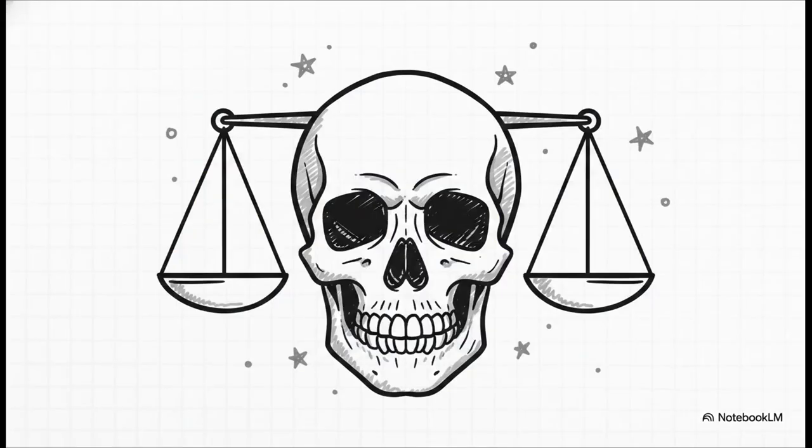Let's bring it all together by noting that despite this dramatic, necessary shift of the anatomy inside the orbits, our strict baseline requirements remain exactly the same. Whether you're performing a straight PA or a 15-degree Caldwell, the final image must still demonstrate the entire cranium without rotation or tilt. You still must have symmetric petrous ridges, equal and equidistant lateral borders on both sides, and those 3 distinct tables of squamous bone around the entire cranial perimeter. A perfect, unrotated skull is just non-negotiable in both methods.